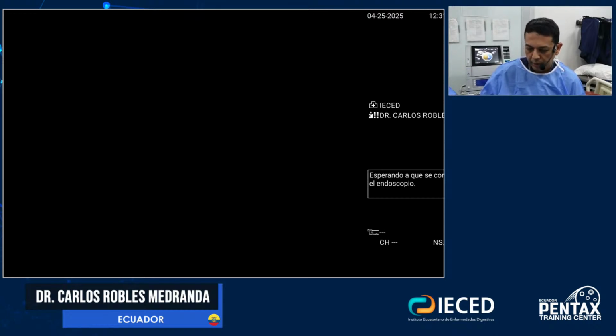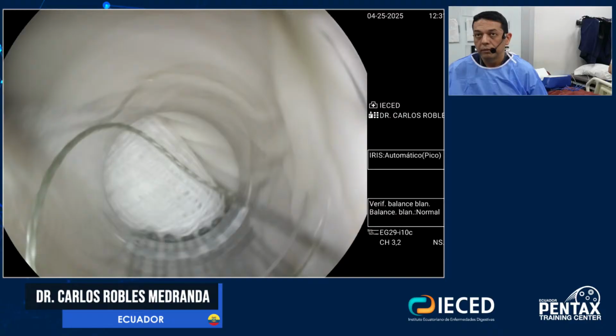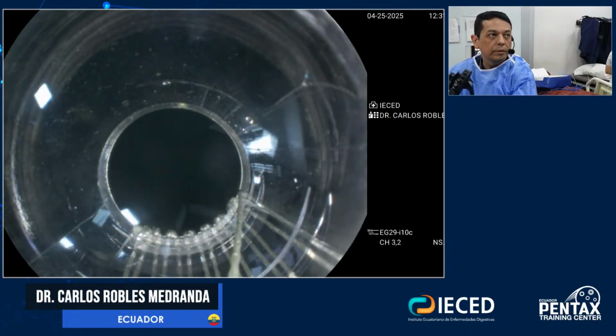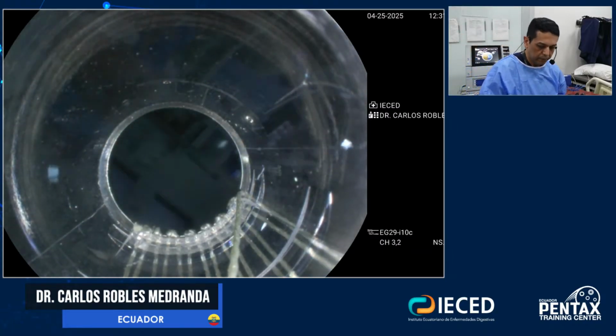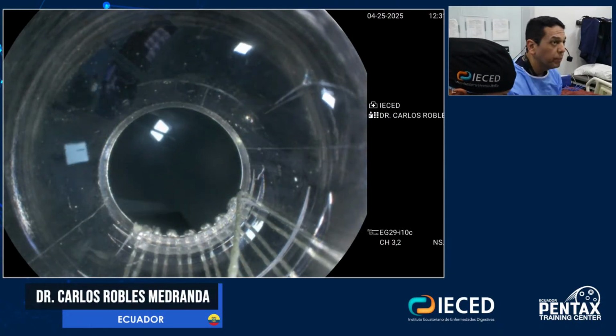So we are preparing the captivator. Let me see. Moment. Okay, so now we are fine. No tengo aspiración y no tengo CO2. ¿Está bien puesto esto?